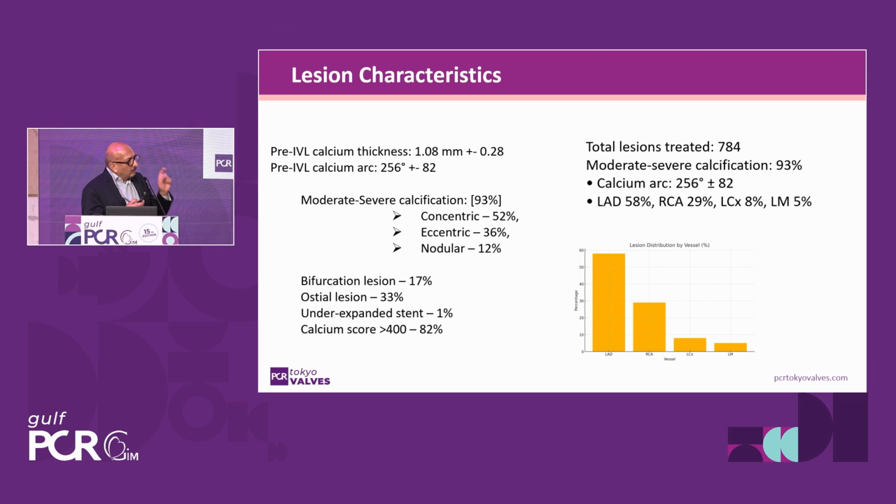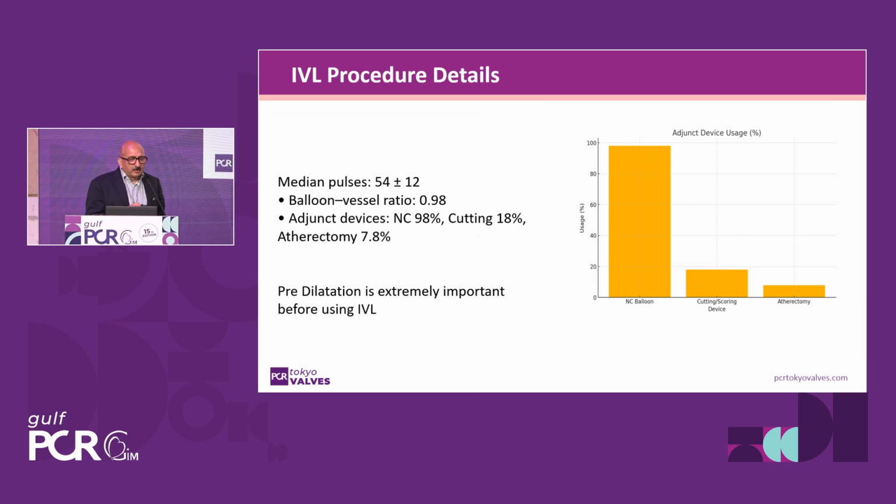So generally we do bursts of 5 each. We do a burst of 5, wait, deflate, and then again do a burst of 5. So rather than going for the 10, you can do a 5 at one time. So that is the trick.